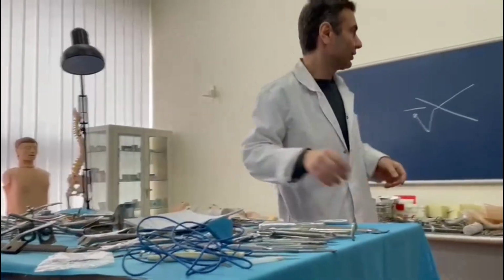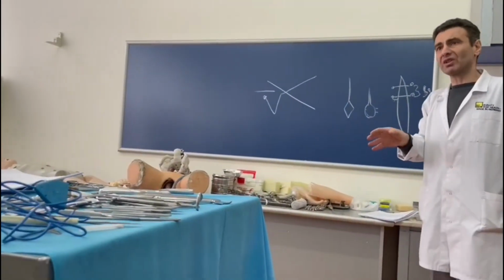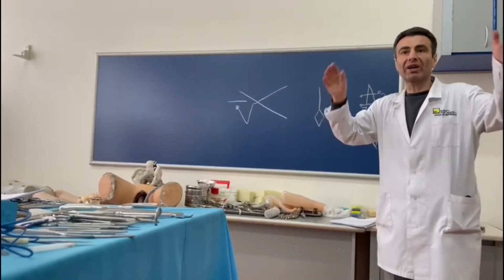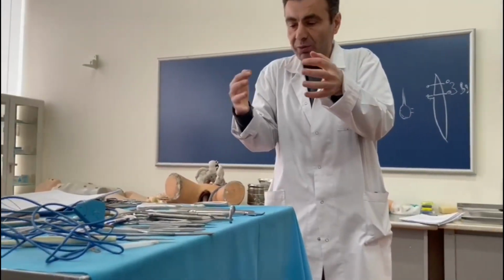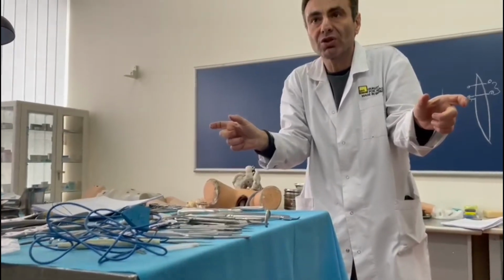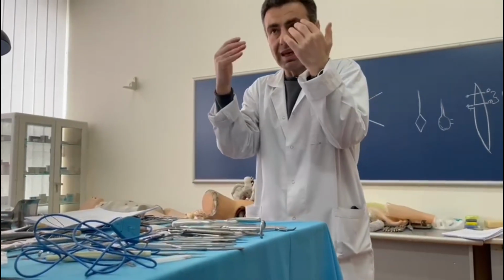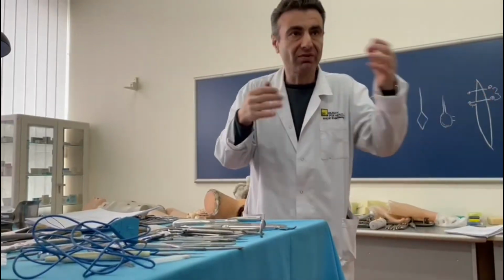For the skin, if you apply the piercing distance normally, it is equal to half a centimeter. If you apply a very big one, for example, 1.5 or 2 centimeters, then when you tie the knot, the margins will be deformed, because a huge amount of tissue will be pressed between the two piercing distances of your suture. Let's say, both big size and small size are forbidden.